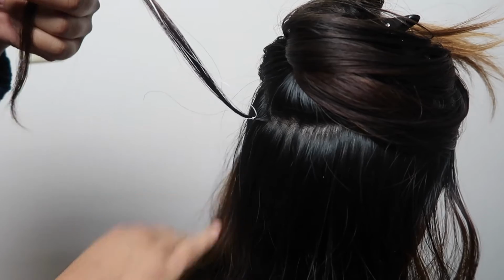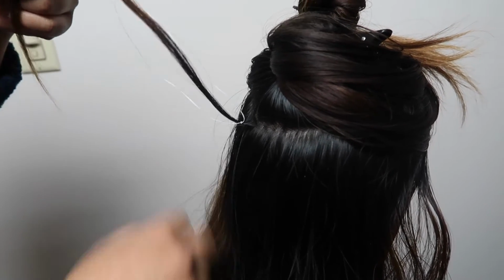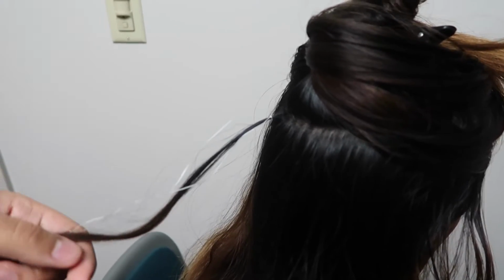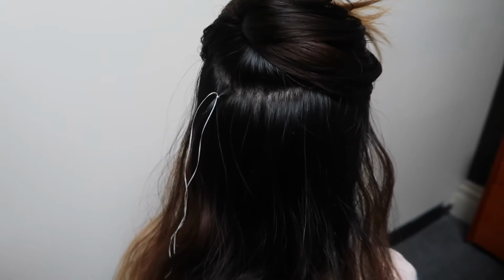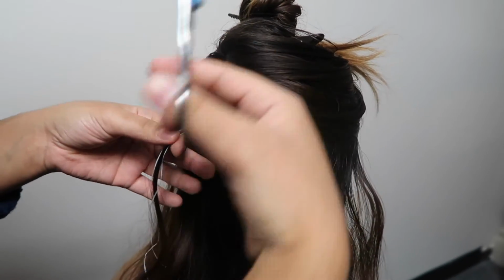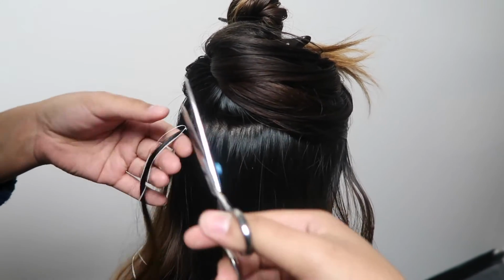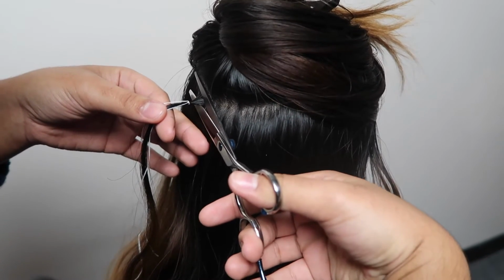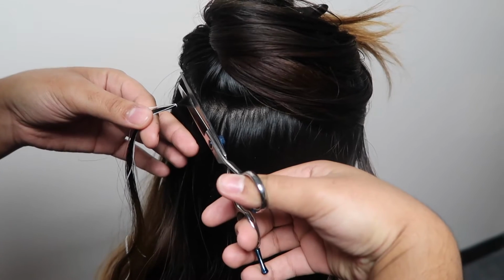We have all of our other hairs to the side, so that way they won't get caught. And then we grab our scissors. So you want to cut as close to the scalp as possible. So you go in from the side and make sure you're not catching any of the other hairs. And again, just as close to the scalp as possible.